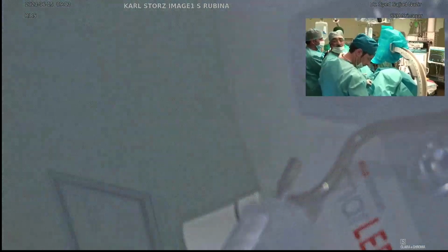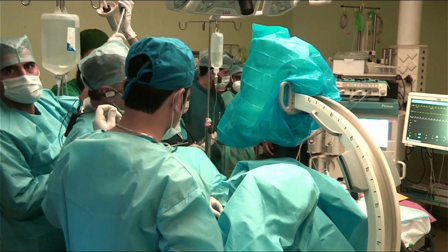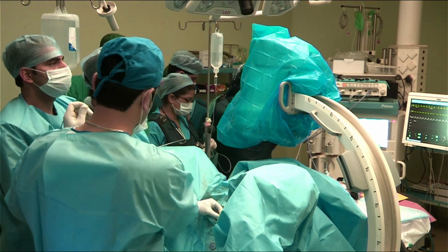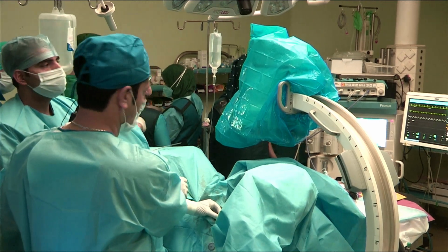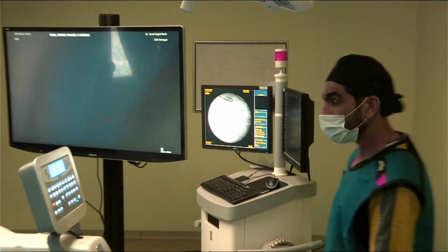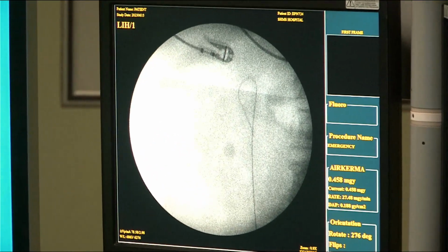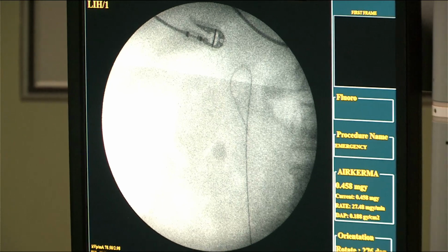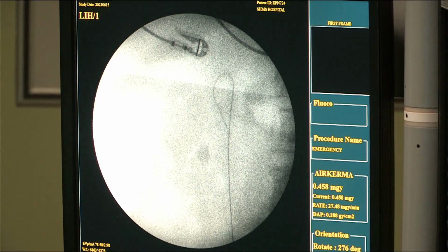Fixed on the CR. Which make is it? Yeah, this is a Scanway, sir. Scanway hands this CR. And who is the anesthetist? The anesthetist is Professor Ruxana's team, and then you have here Dr. Arshi, Dr. Ashok and Dr. Humaira. Okay, and we can't see Dr. Ruxana there? No, she's in the other OT.